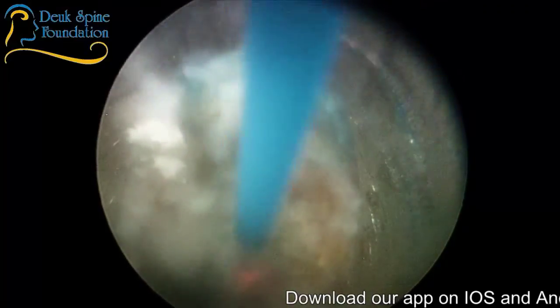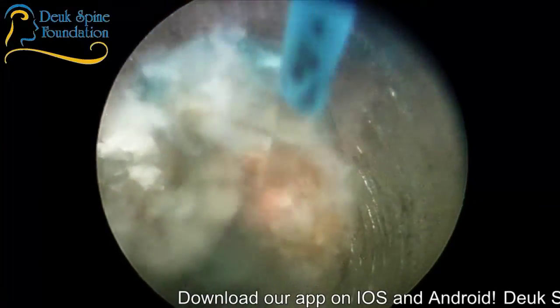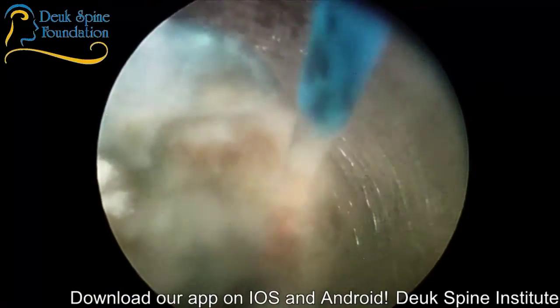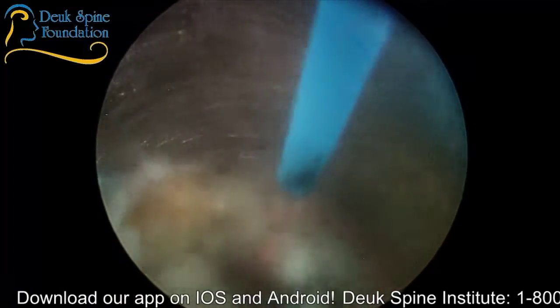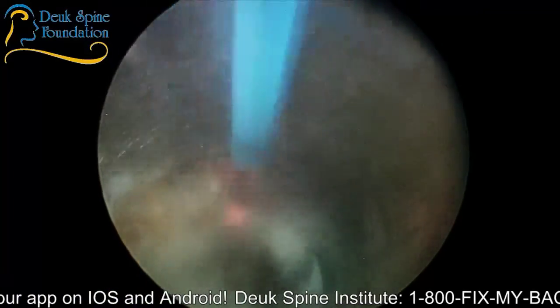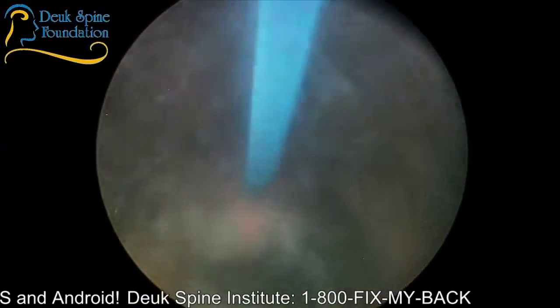But this is the end of the tear right here at L5S1. I'm going to be coming out in just a minute, and then we're going to move to the next disc. We're going to do the same thing at the next disc. We're going to basically vaporize the annular tear, get rid of all that grungy material, that inflammatory tissue, so that this can now heal.